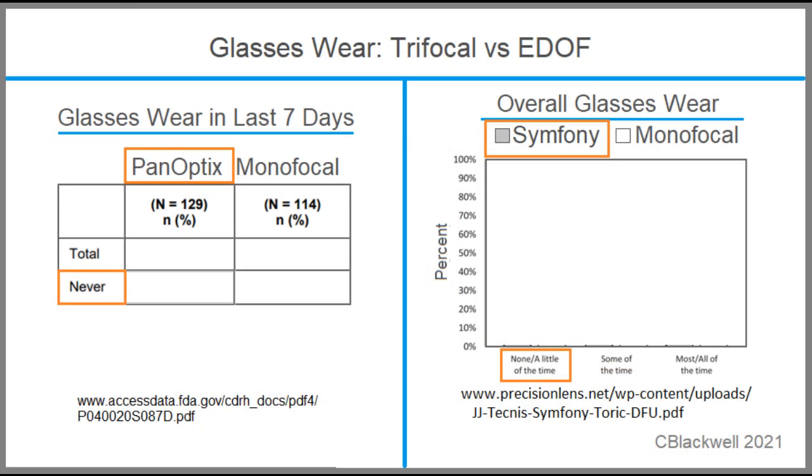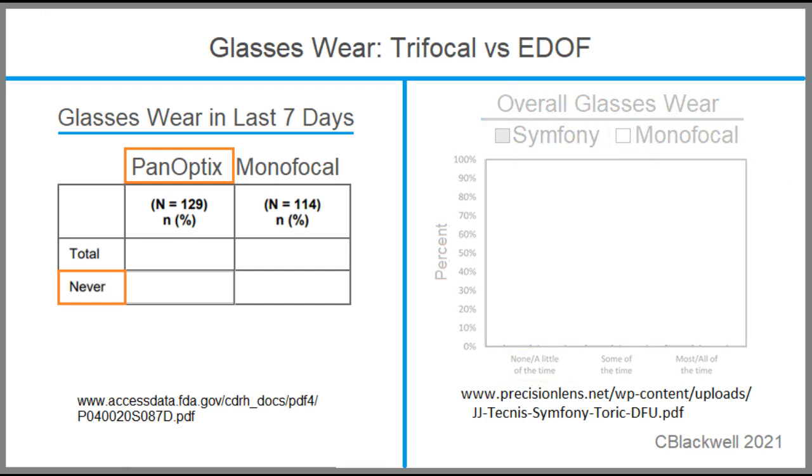Another answer to this question comes from the lens manufacturer's own studies. Here they report what percentage of multifocal users were able to reduce glasses wear. This is PanOptix trifocal versus Symfony EDOF. Each asks the glasses question in a different way. For the PanOptix trifocal, the question was if they had worn glasses in the last 7 days. About 80% of patients reported not wearing glasses in that time, compared to those with monofocal lenses where reading glasses were needed over 90% of the time.